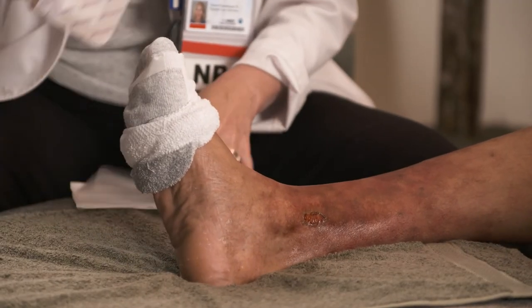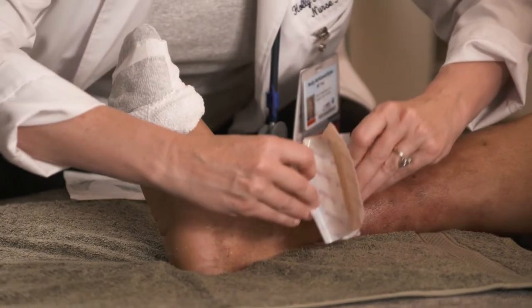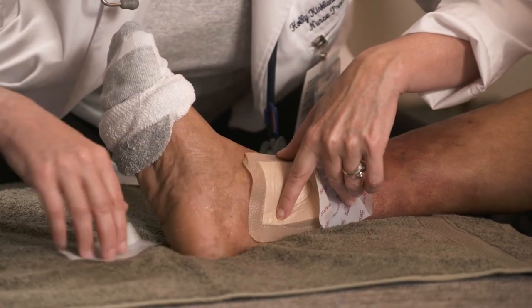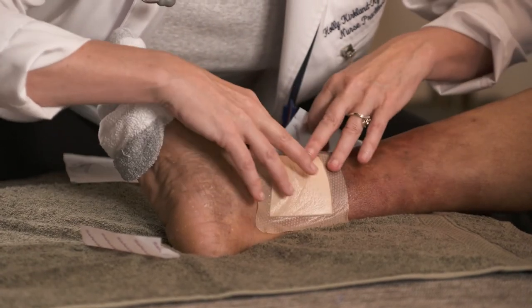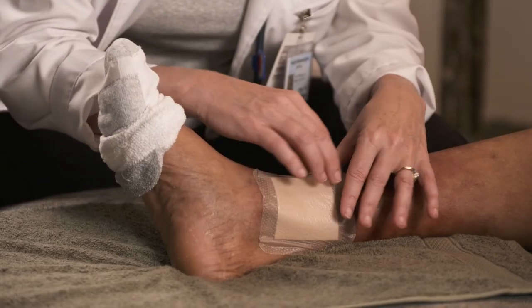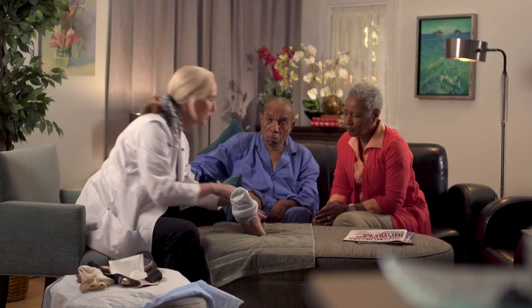Then you'll have a dressing here and you just apply the dressing. This is a silicone dressing. As you apply it, you can stretch it over the wound and then even it out. I like to use the silicone dressings — they're available at your regular grocery store or even at any pharmacy. And they don't stick to your wound, so when you remove it, it shouldn't tear the skin or any of the wound either. So it should be painless.